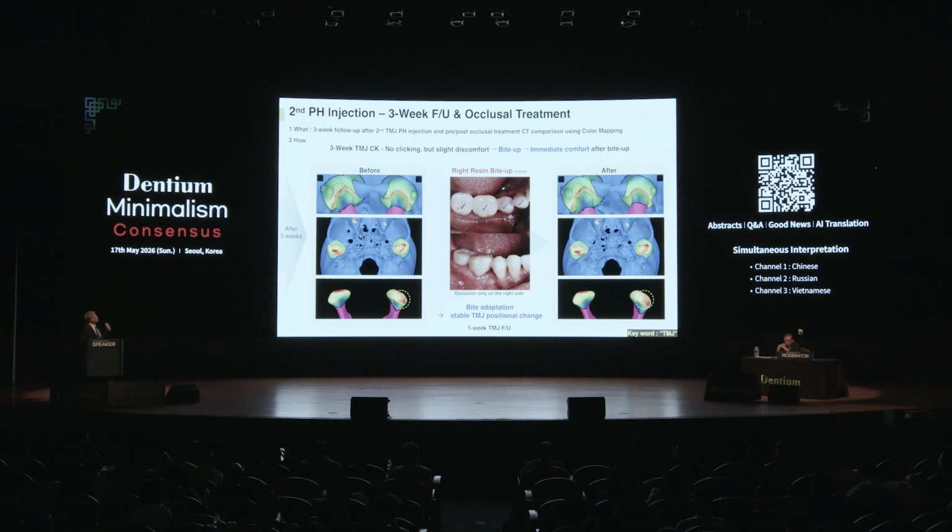So the patient became comfortable on the right side, because the patient had some crepitation on the right side, but that was controlled. With that concept we tried to reduce the crepitation on the right side. Not yet completely, we can't assure that, but with a clear image of the TM joint, that is the way for the treatment.